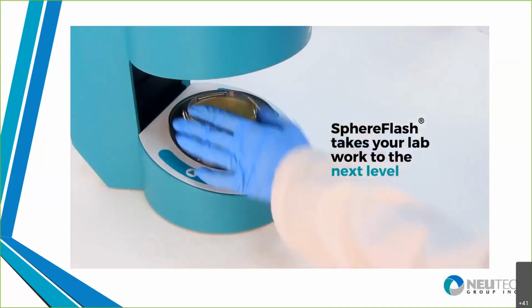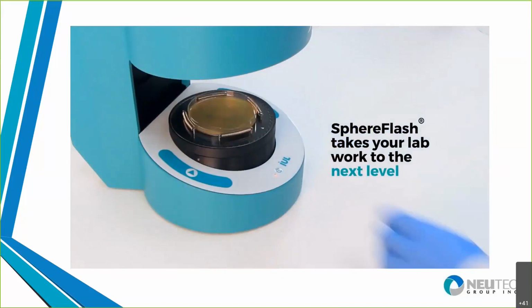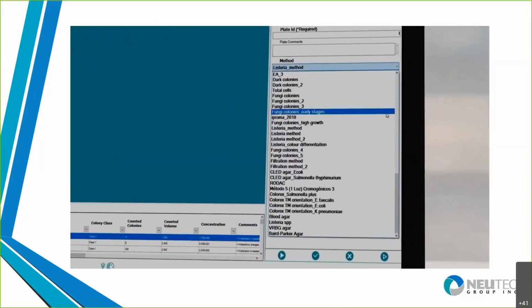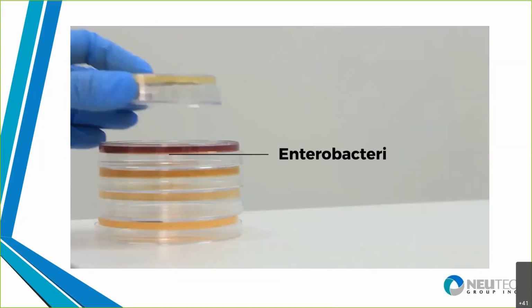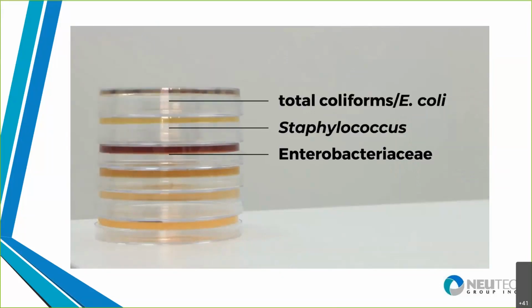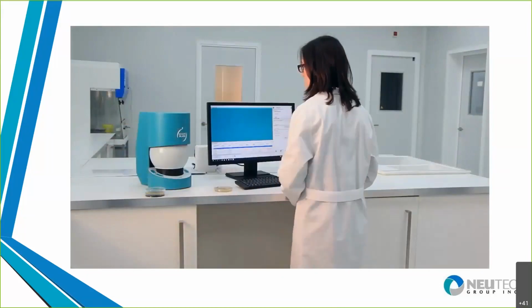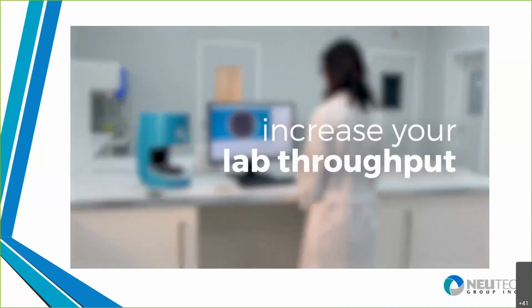According to how you've set up the software, it does the counts and transfers those results. And the calculations are done based on any kind of dilutions that need to be factored in to give you an actual true colony count. And then the results in a CFR Part 11 protected way will allow that data to be automatically put into a LIMS system. So really, this is a critical part of the process.